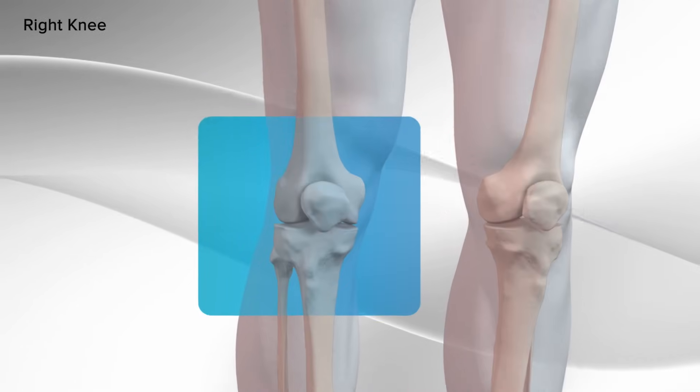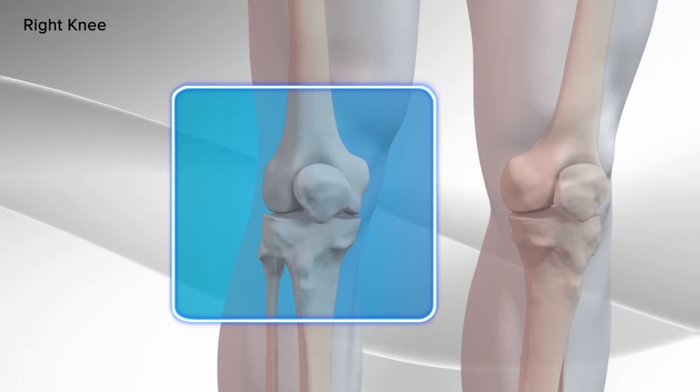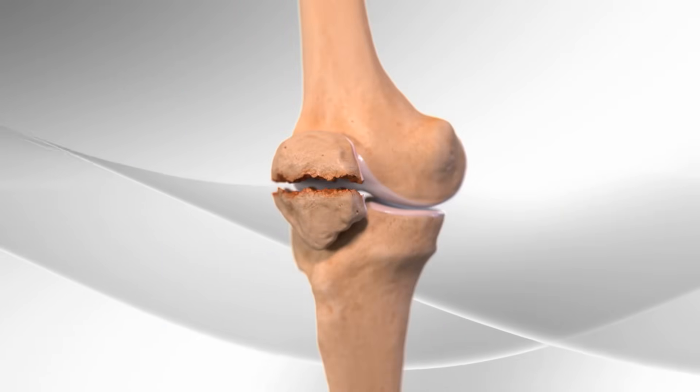In this video, we'll demonstrate the repair of the broken patella in the knee using a surgical set designed to fix it.